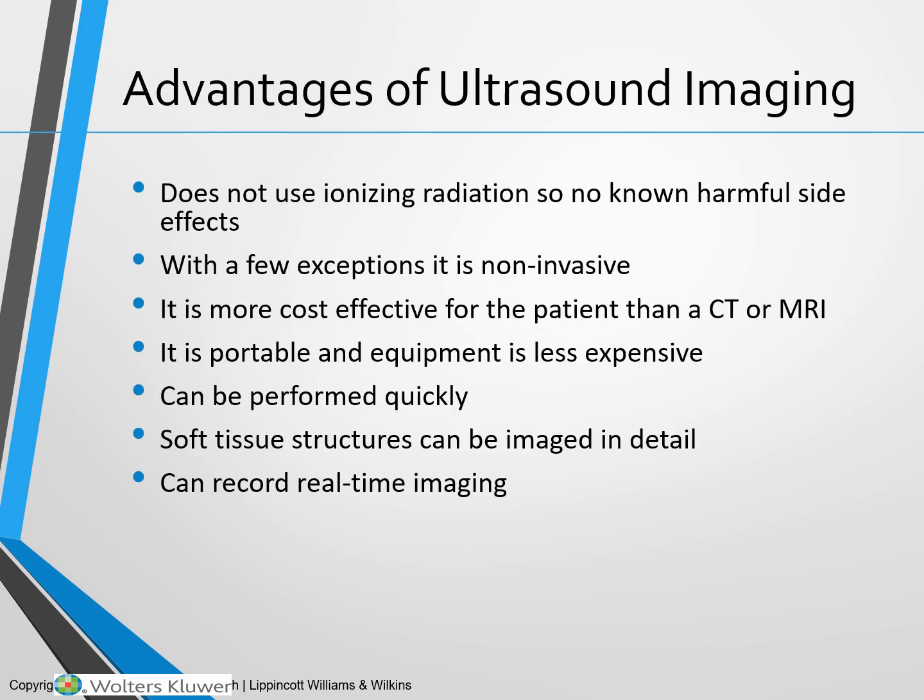Here are some advantages of ultrasound imaging. Ultrasound imaging does not use ionizing radiation, so there are no known harmful side effects. With a few exceptions, it is non-invasive, so we do biopsies, which would be considered invasive. We do transvaginal ultrasounds, which could be considered invasive, but for the most part, it's a non-invasive procedure.